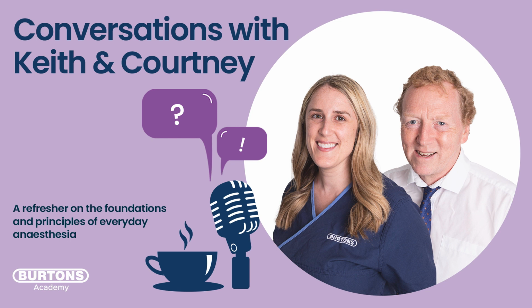And the human brain likes comfort. I think 10 is comfortable. And I'm going to use 10 again for our tidal volume. Okay, so 10 mils per kilo. And I know there'll be aficionados out there who would say that it should be 9.8 in this species, and it should be 12 mils per kilo if you're doing this. But yes, I accept all that. But if we're going to approach ventilation, let's start with 10 centimeters. Sorry, 10 mils per kilo.